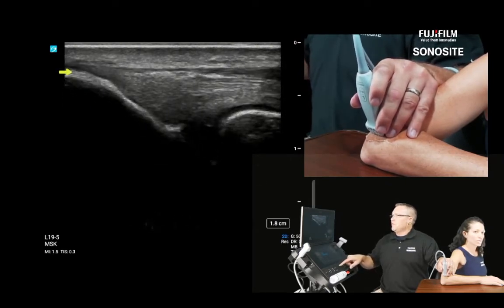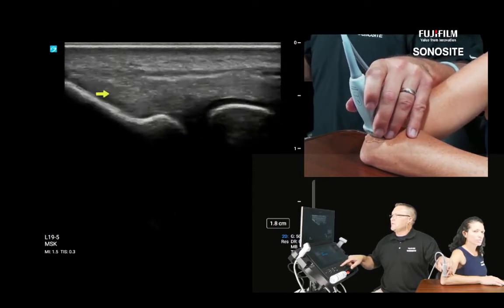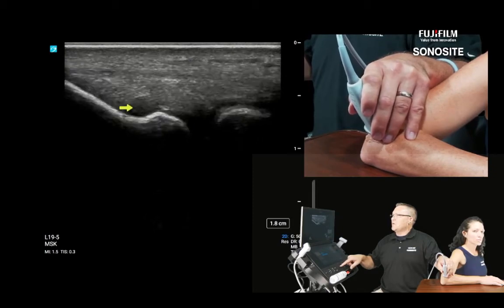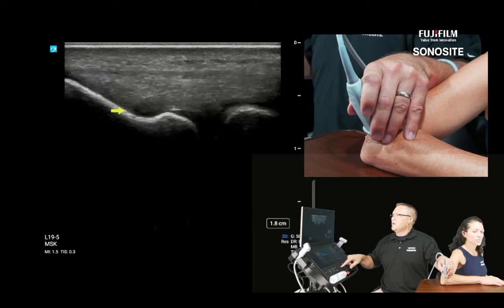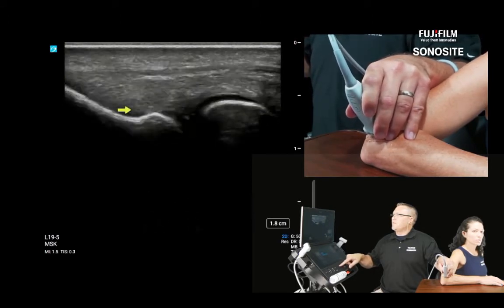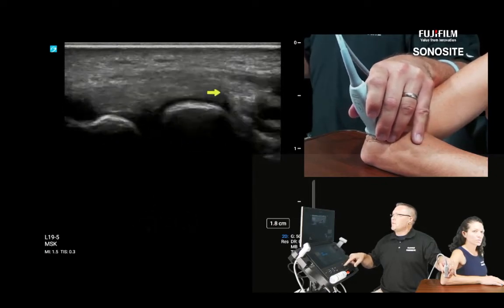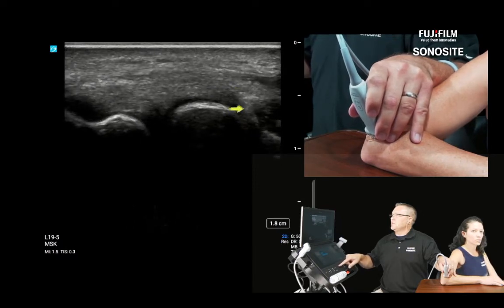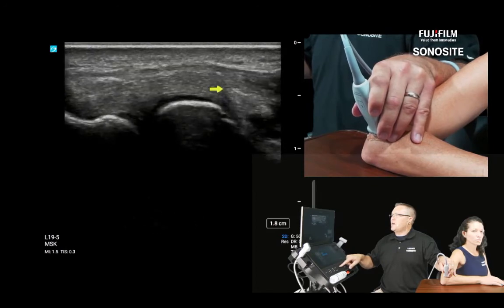So here's our lateral epicondyle, that first 2/3 being the common extensor tendon, and then that lower 1/3. And actually, I can see that anisotropic artifact just making itself a little bit more known right here in that almost neck of the epicondyle, if that's such a thing. I'm going to follow this ligament up over to the annular again. And what I like about this transducer is I'm able to see this edge artifact representing the distalmost portion of the annular ligament complex.